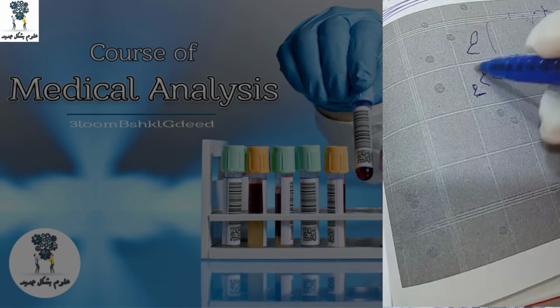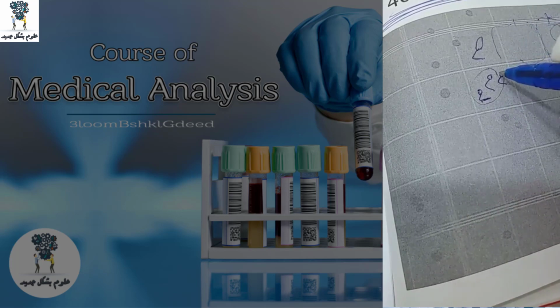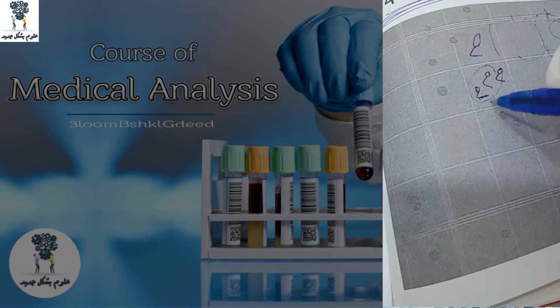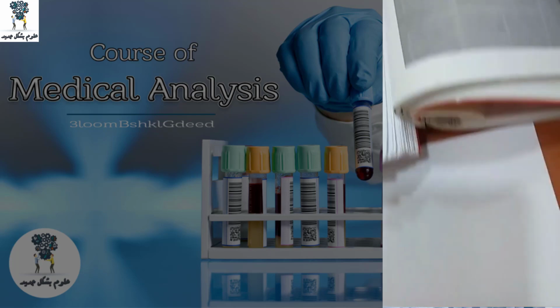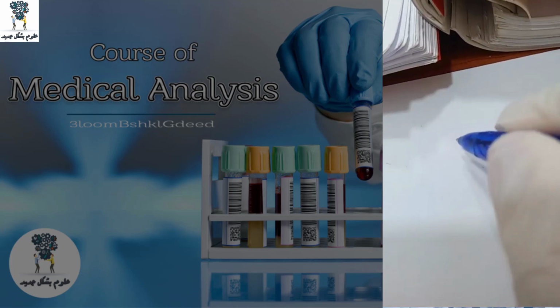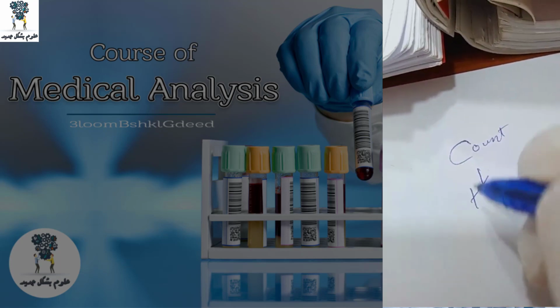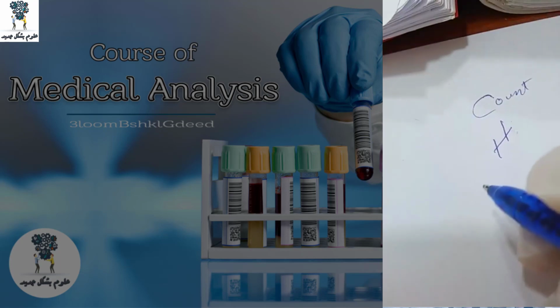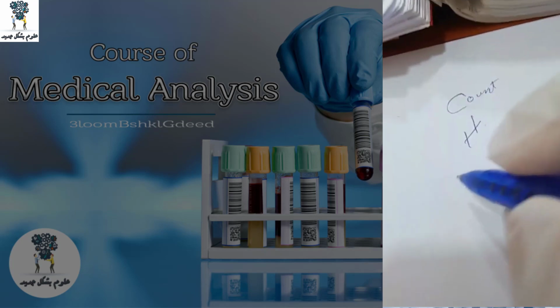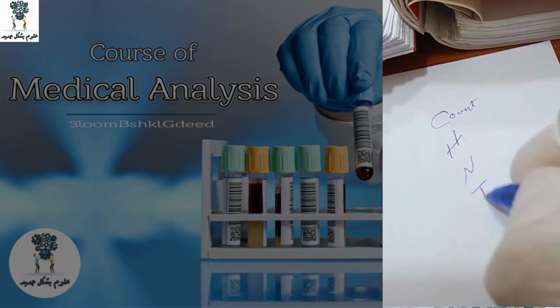It's okay, I will count that. In square number 6 there are 3 tails. We will make our calculation in the 25 squares. We will see this in the lab if you enter the lab. Head, neck, and tail.